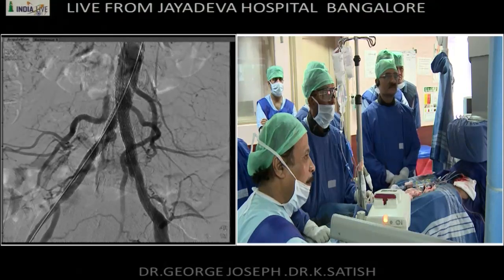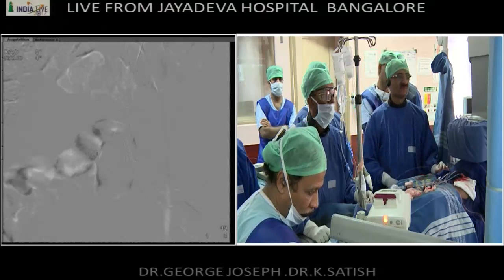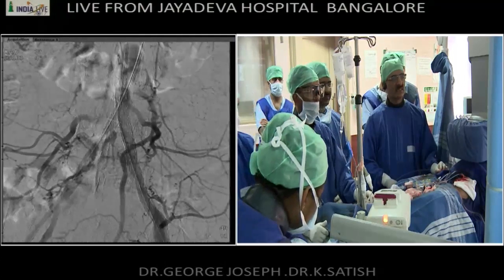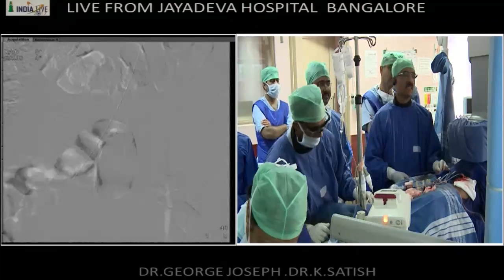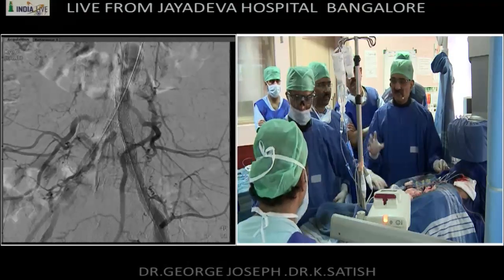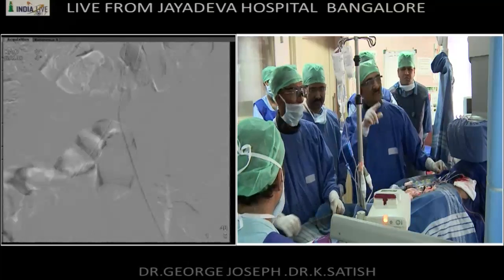So probably you will need another stent on the right side. Yeah, we could take a stent and take it into the external iliac, but I won't balloon it. So we have another 8 by 60 or something? No, 7 is small inside.